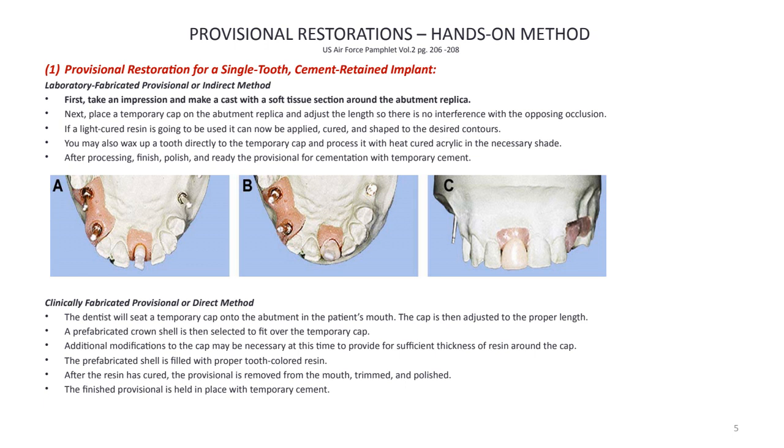You may also wax up a tooth directly on the temporary cap and process it with a heat cure acrylic in the necessary shade.